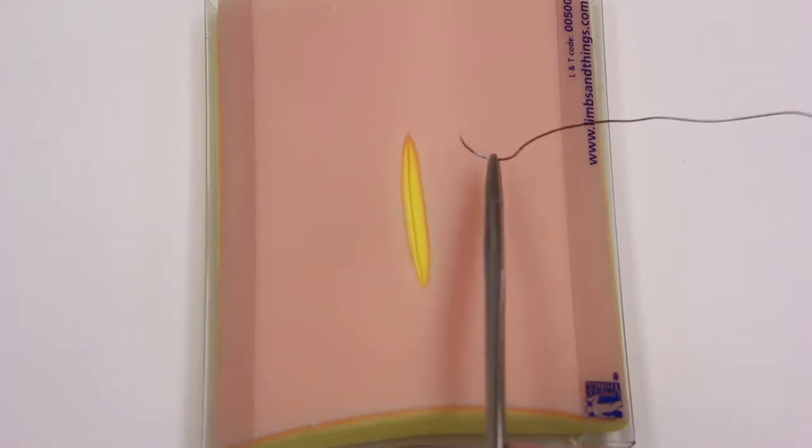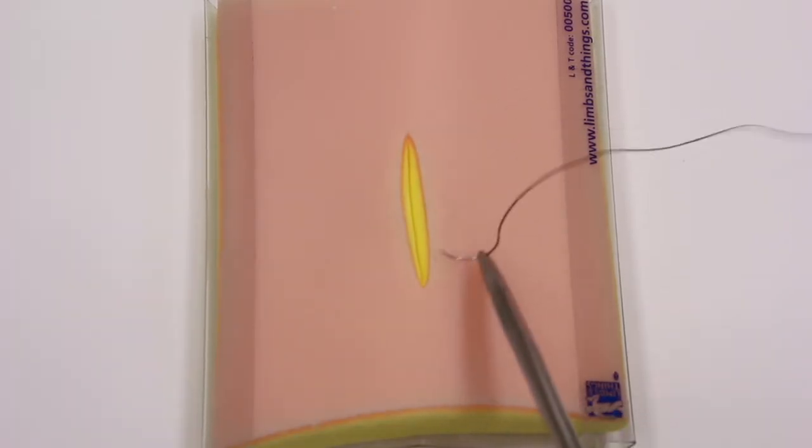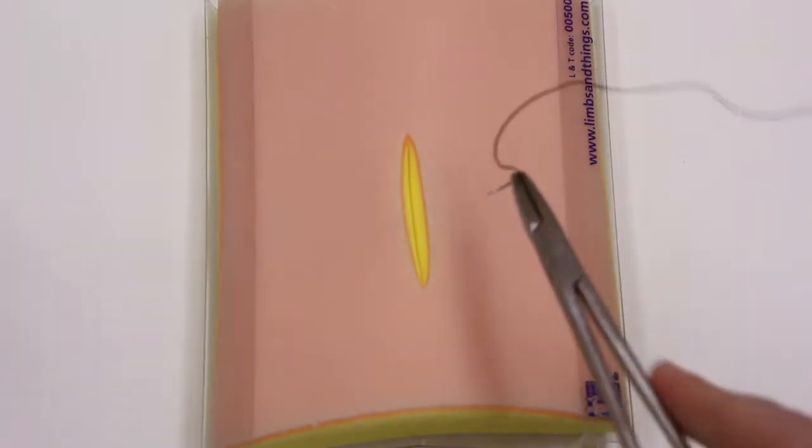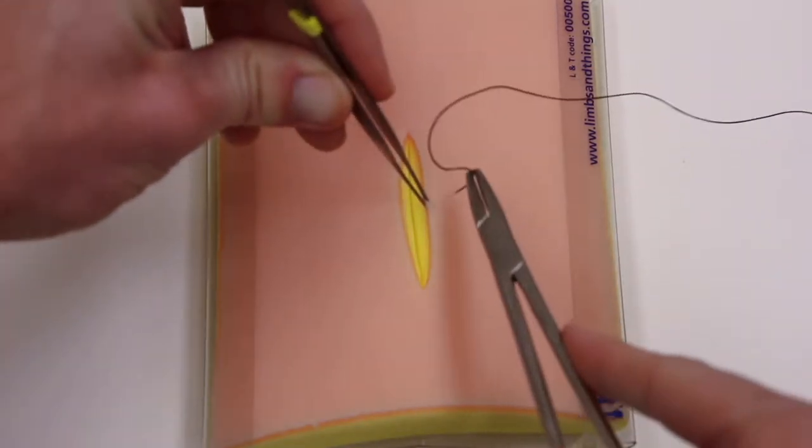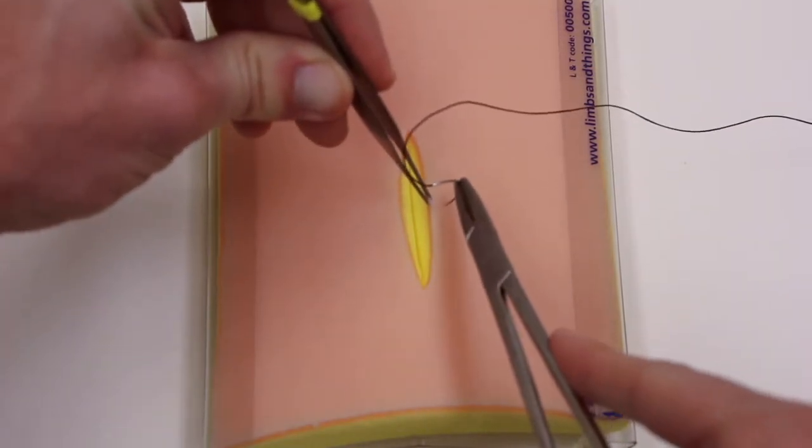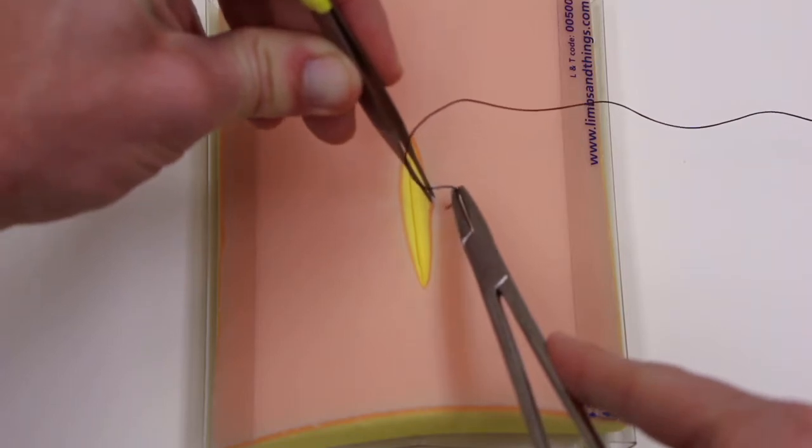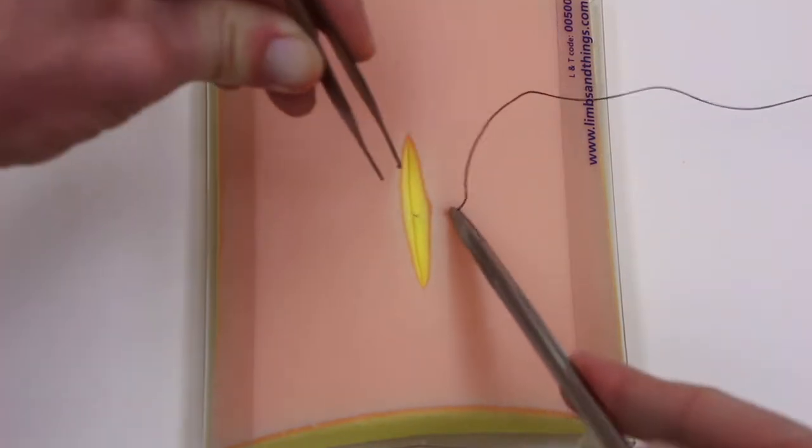So in looking at the incision itself, your first should be about halfway between. Now grabbing the skin edge, needle entering orthogonal to the skin, perpendicular to the skin. Your first one is often easier to take in two bites.